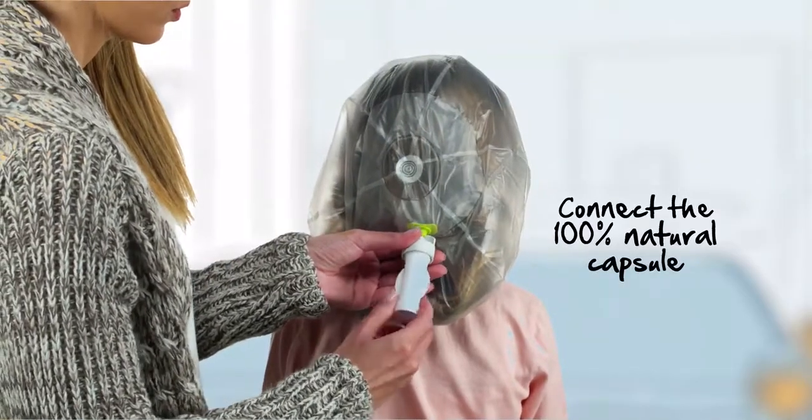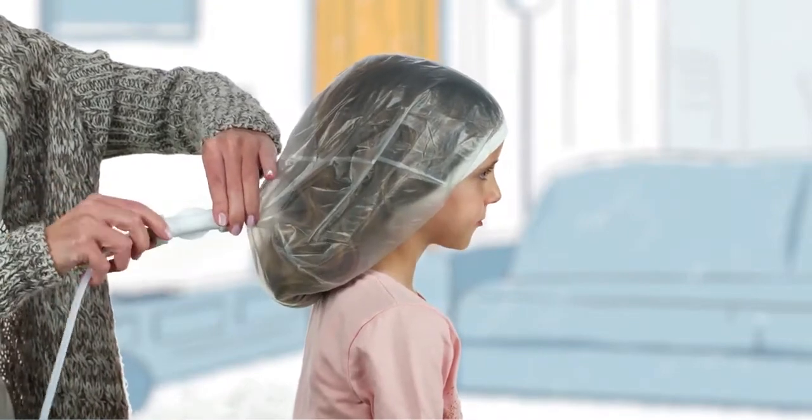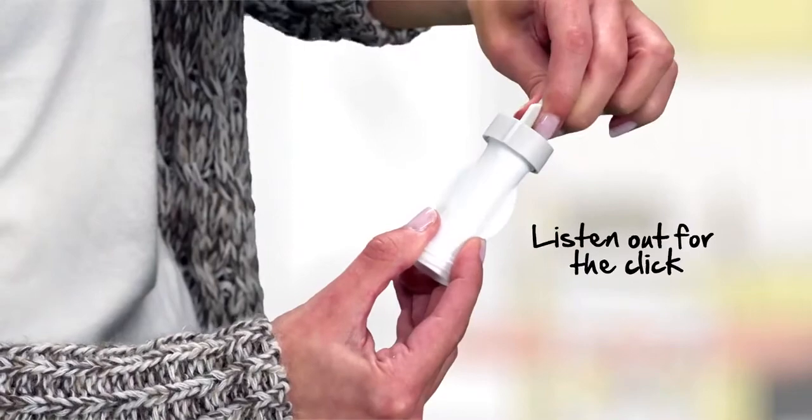Take a capsule and connect it to the connector placed on the cap. Connect the other side of the capsule to the connector placed on the end of the tube. Listen out for the click.